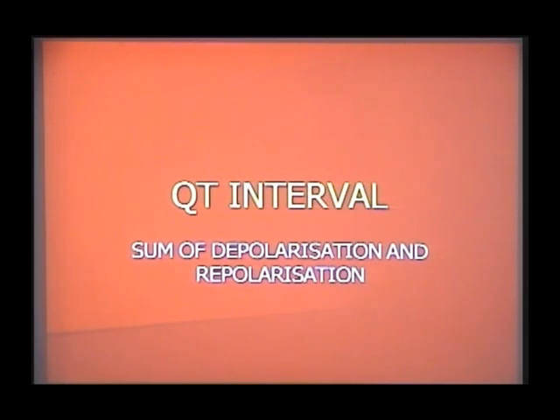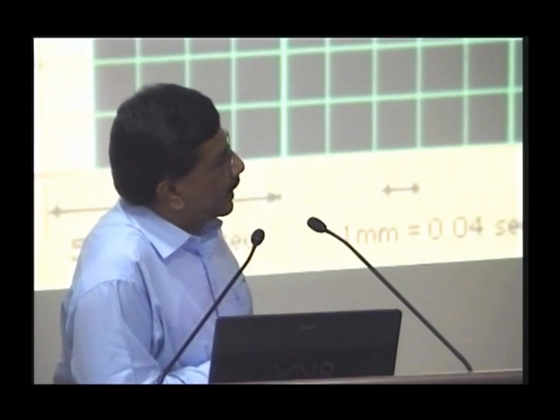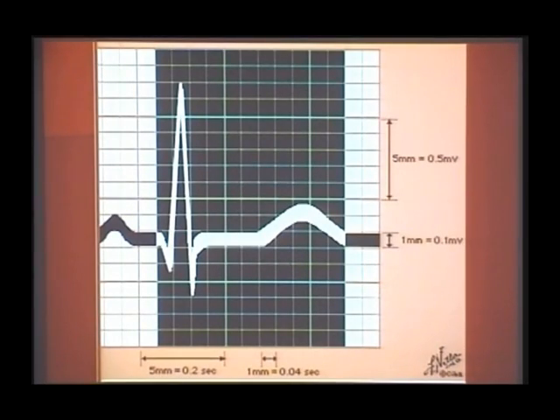When you measure the T wave, you measure the repolarization. In the QT interval, I am measuring both: from the beginning of depolarization to the end of it, the entire depolarization, then the ST segment between depolarization and repolarization, and also the whole of repolarization. The QT interval is usually measured in lead AVL.